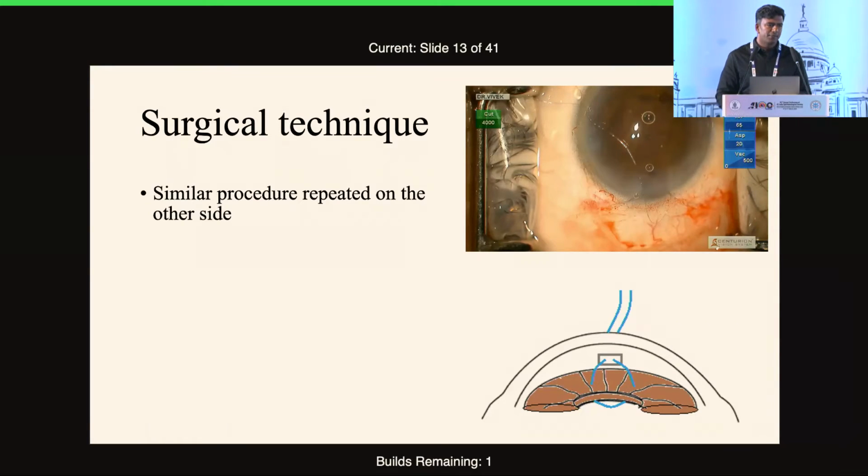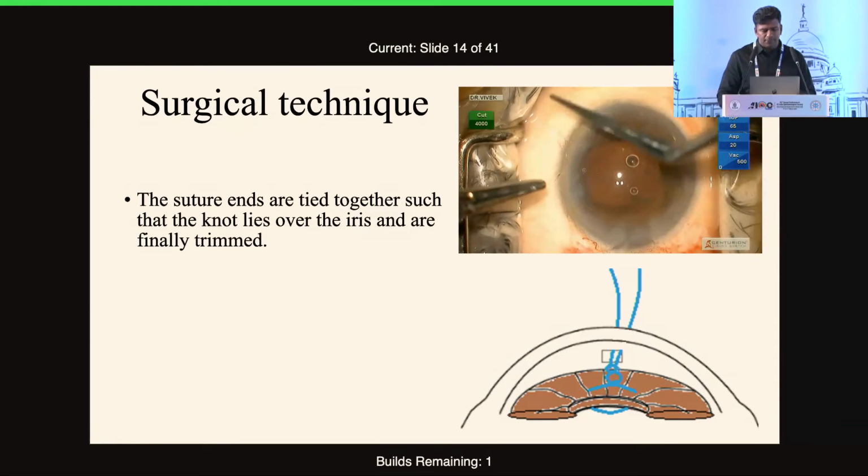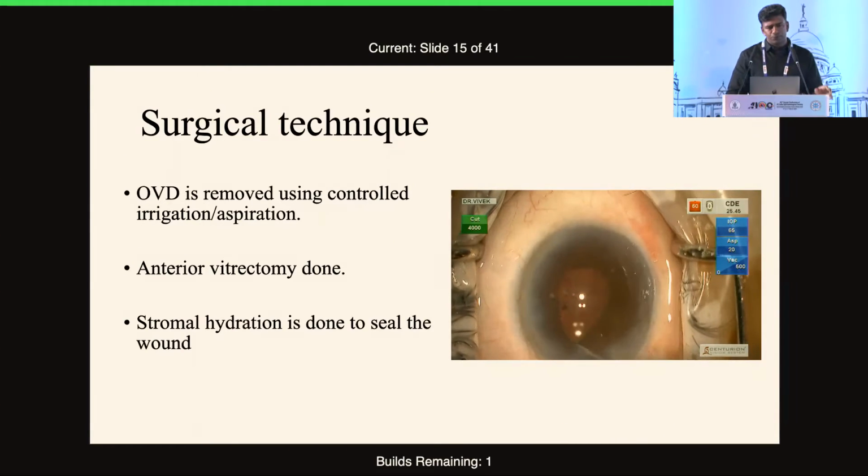This takes time. It takes a couple of cases. The learning curve is a little longer for this technique for this one reason. The knots are placed and pushed inside. They are trimmed and pushed, following which viscoelastic is done.